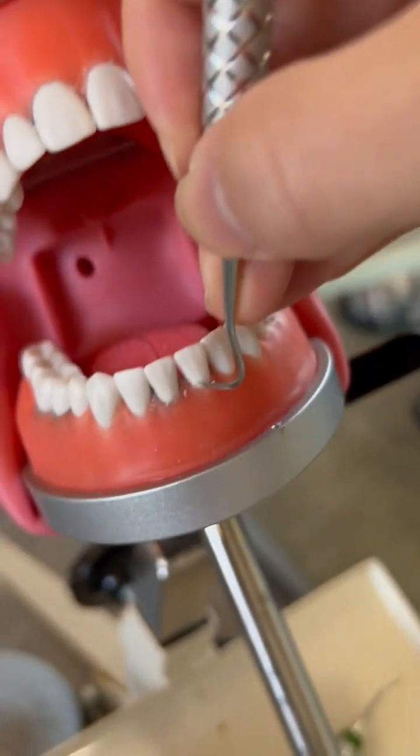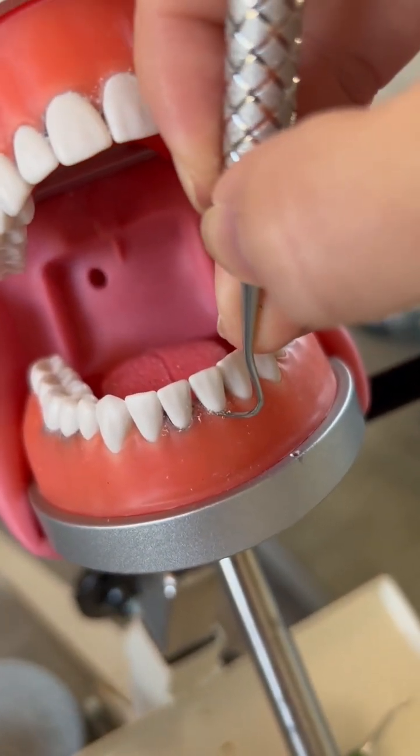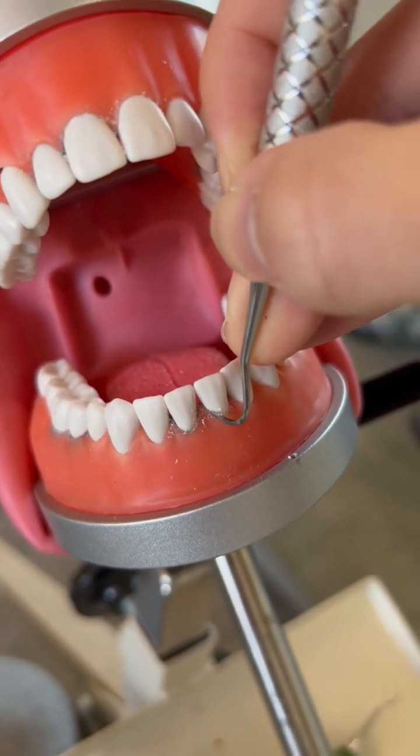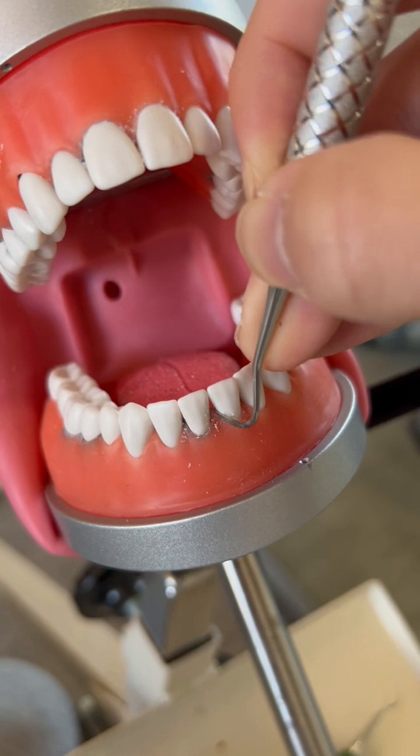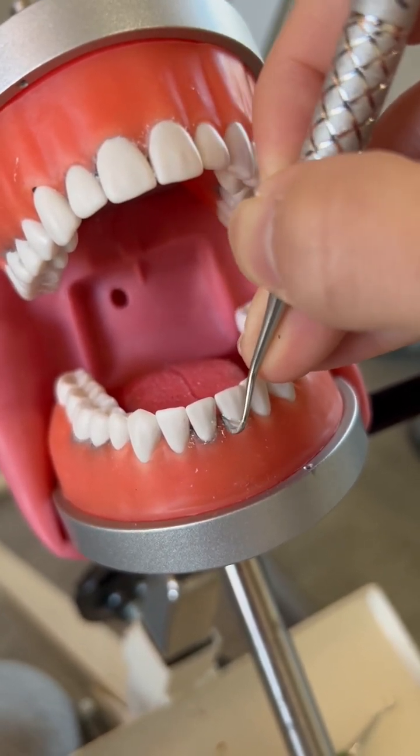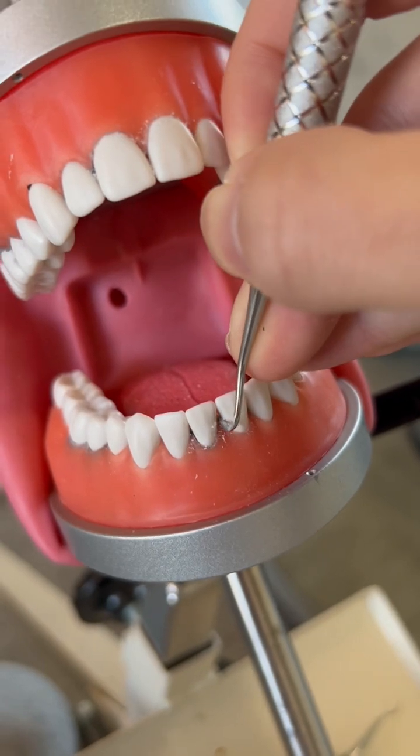Start at the midline, side to side, pivot and roll, side to side, pivot and roll, and only go half of the interproximal space.